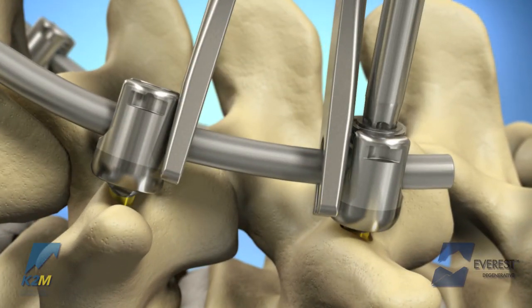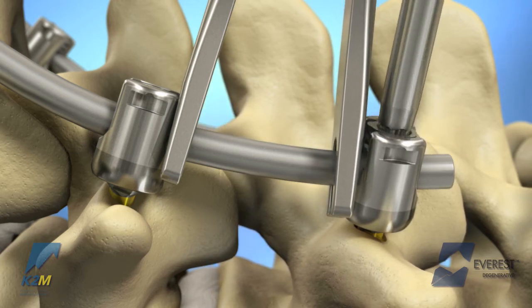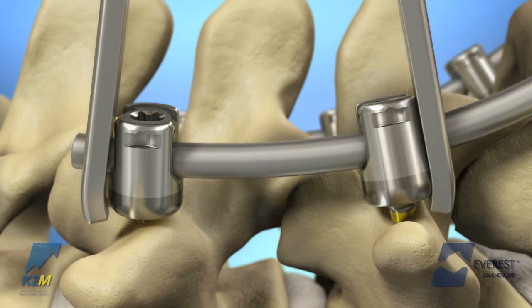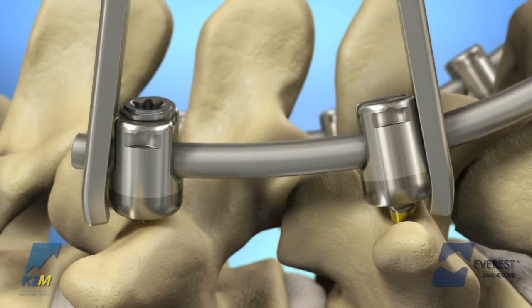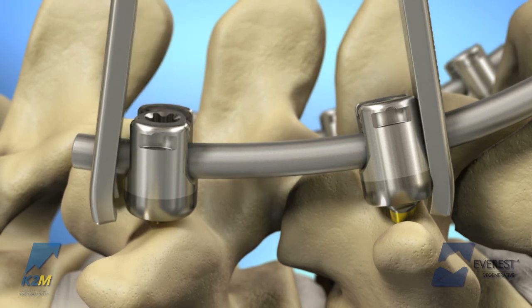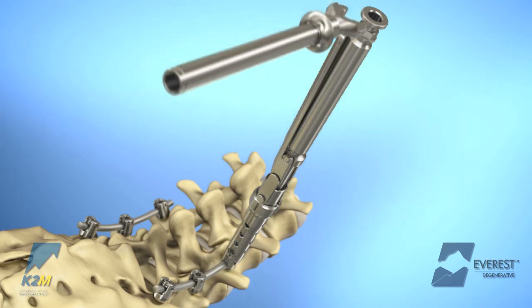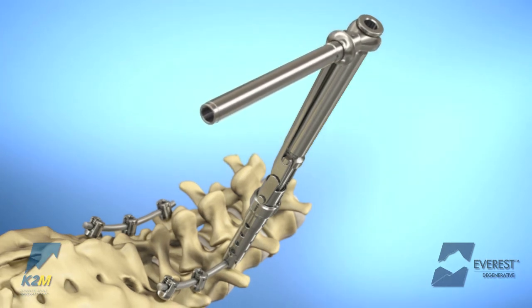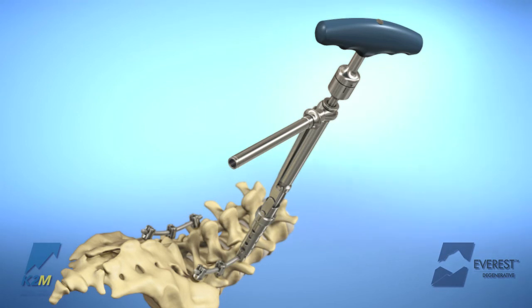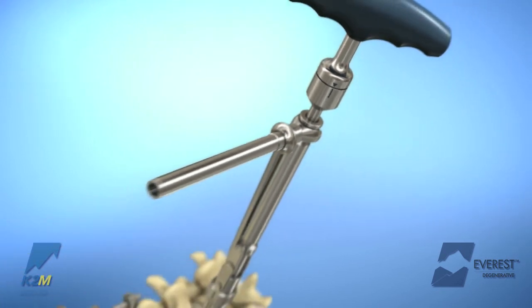Compression and distraction may be performed with the Everest implants while the set screws are provisionally tightened. Once the desired amount of compression and distraction has been achieved, it is necessary to tighten the set screw sufficiently to hold the implant in position. Final tightening of the Everest implants is achieved using either the cicada or the anti-torque alignment tube attached to the anti-torque handle. Insert the torque wrench into the top opening of the cicada and introduce the torque wrench tip into the set screw. The appropriate torque level of 90 inch-pounds is achieved with the torque indicating wrench when the line and the arrow meet.